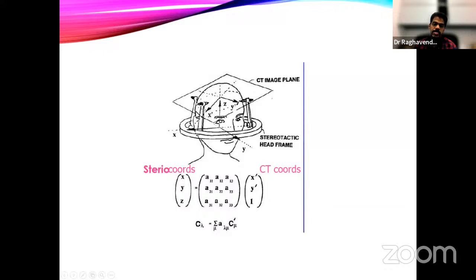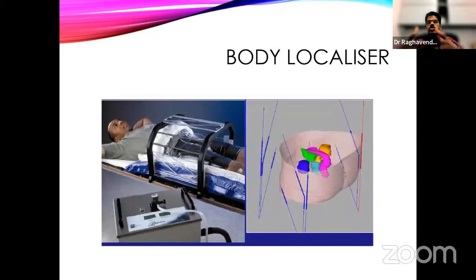If you see this XYZ on the localizer, you can mark it on that localizer, which is very easily markable. The mark corresponds to the point XYZ inside the patient's brain. So this is the beauty of this. I hope everybody understood. If there is any confusion, you can always ask me in the last section.